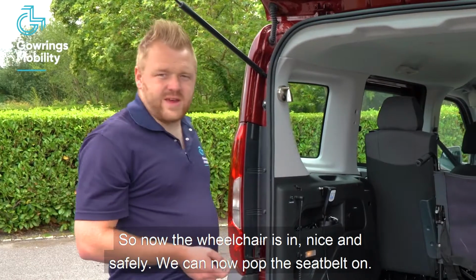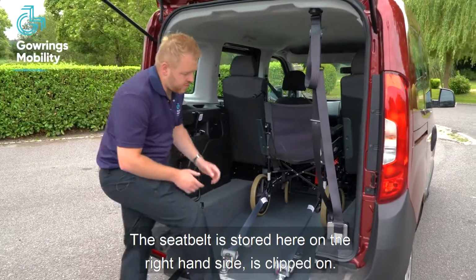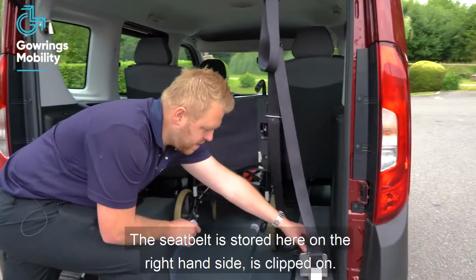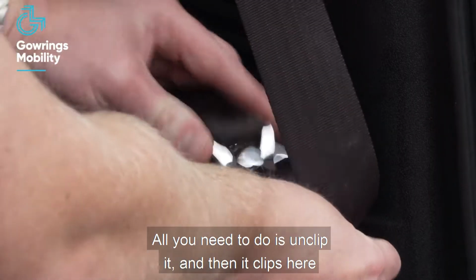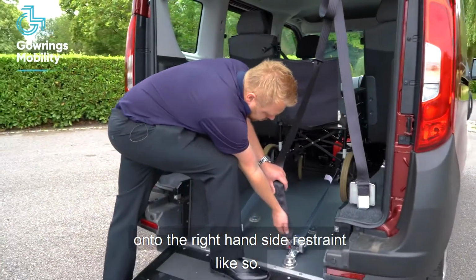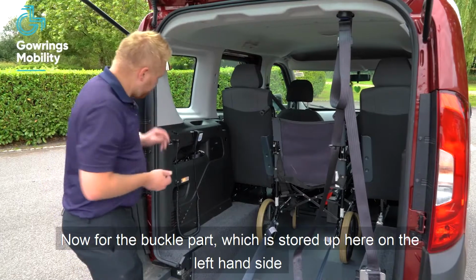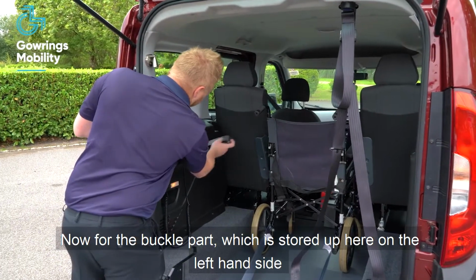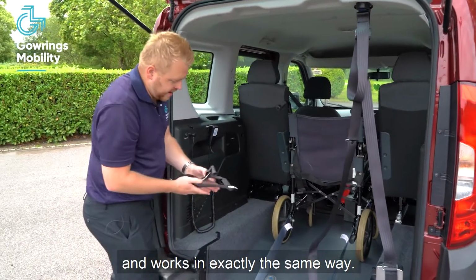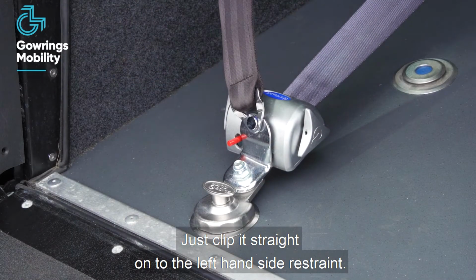So now the wheelchair is in nice and safely, we can pop the seatbelt on. The seatbelt is stored here on the right hand side, it's clipped on. All you need to do is unclip it, and then it clips here onto the right hand side restraint, like so. And now for the buckle part, which is stored up here on the left hand side, it works in exactly the same way, just clips straight on to the left hand side restraint.